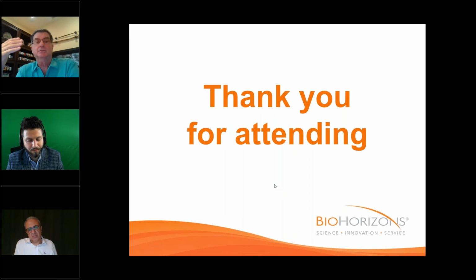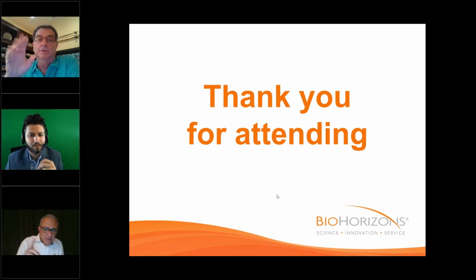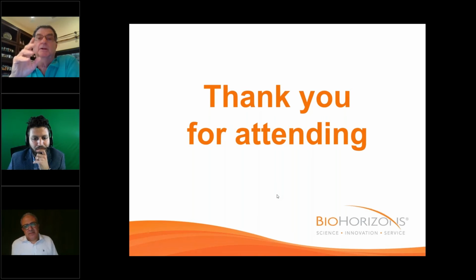So I would say that I presented that at the Academy of Periodontology about 6 months ago as the place that might be ideal for that kind of thing. So I presented it there. You know, your thoughts, Bill? That might be the ideal place. You know, it can be done in any tooth, but it might be the ideal place, better than other techniques. Therefore, you don't have to rebuild the buccal plate.